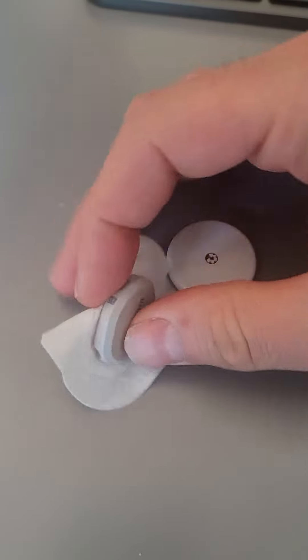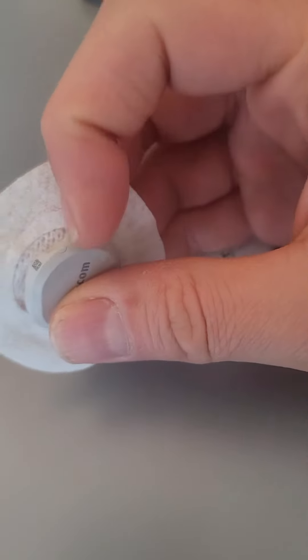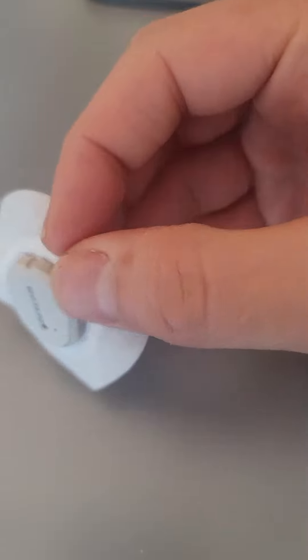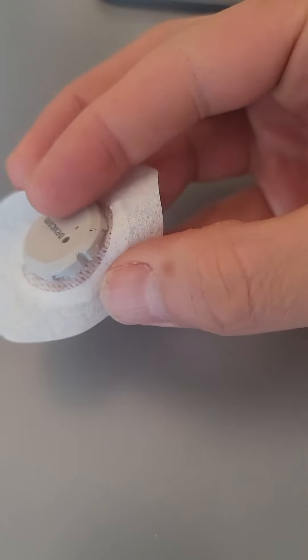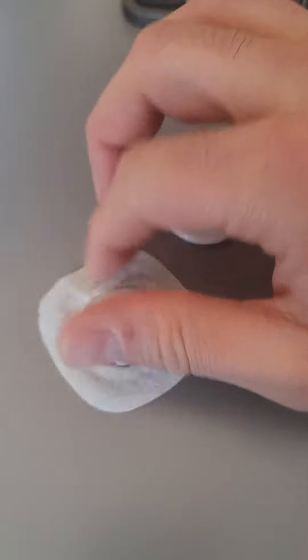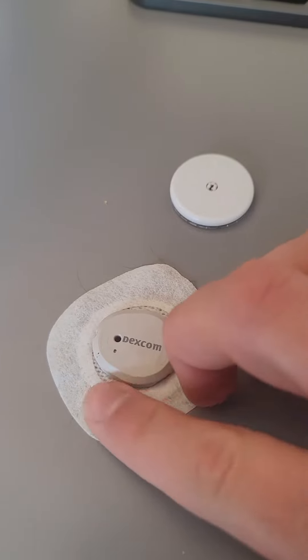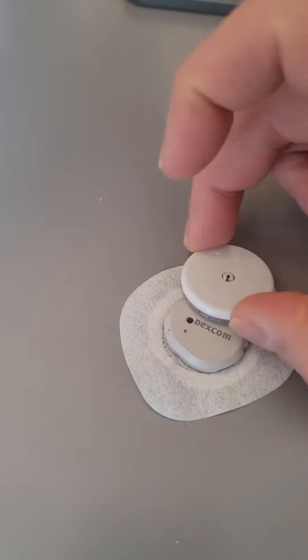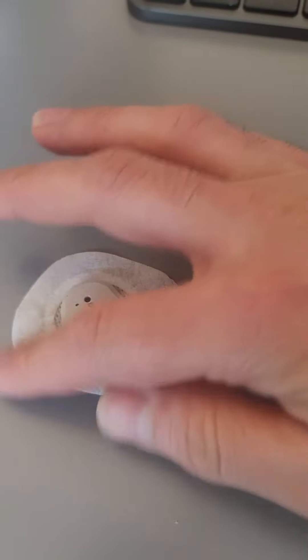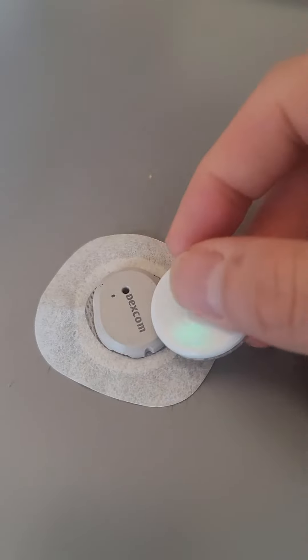Now look at this one — I wish somebody would explain to me what these things are for. Perhaps the designer was told to make a device just for placing the sensor on the skin, and they forgot that after you start wearing it, what happens when the device is thick and has these bad kinds of edges.